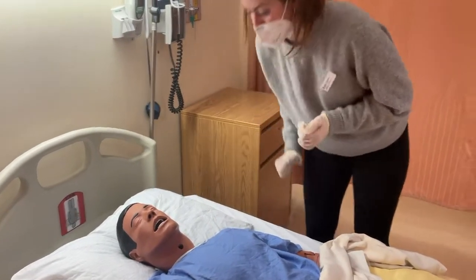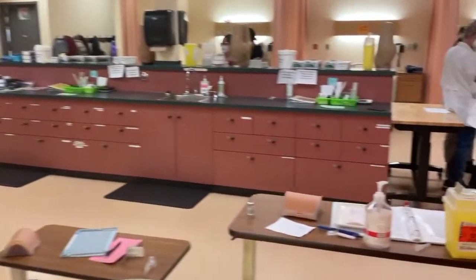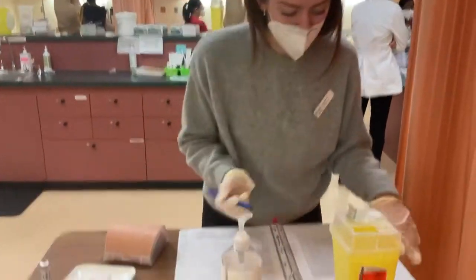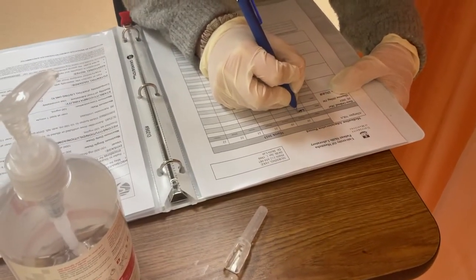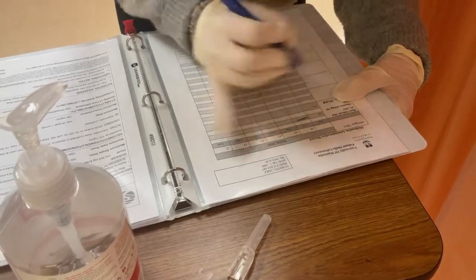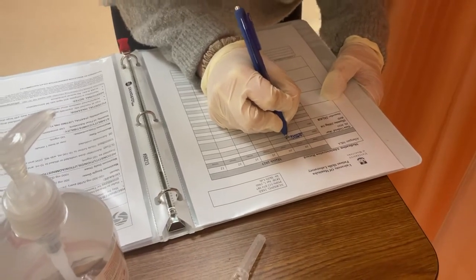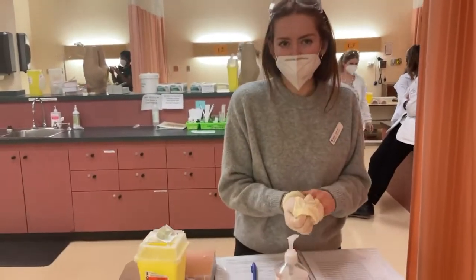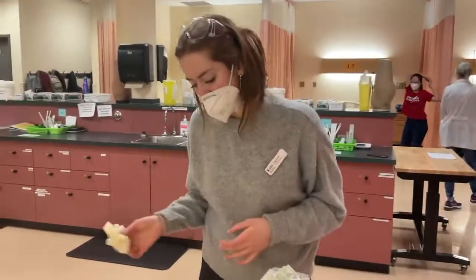Okay, good job. So I will perform a safety check. Call bell in reach. Room is clean, free of debris. And I will now document. So I'll make sure I put it in the left deltoid. Okay, and I will do SR for my initials, SN2, and that is the morning dose given. So I'll remove my gloves. Ooh. I now notice I should have removed my gloves after administering the medication.